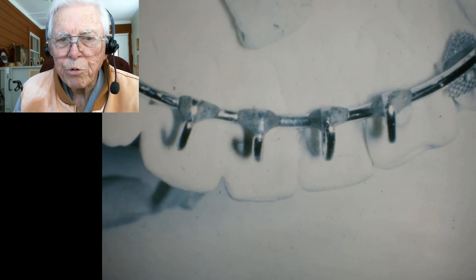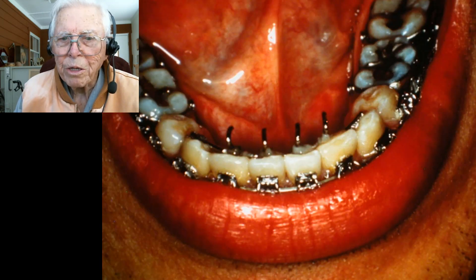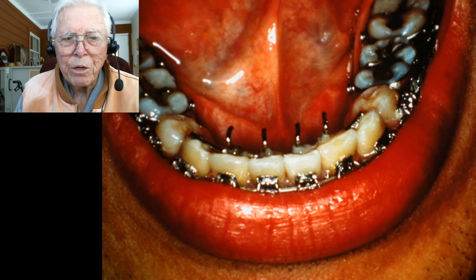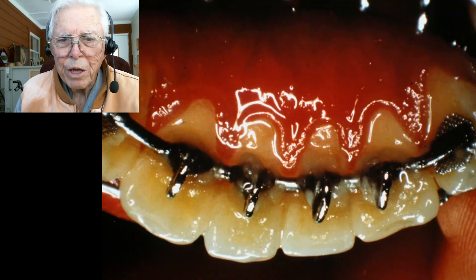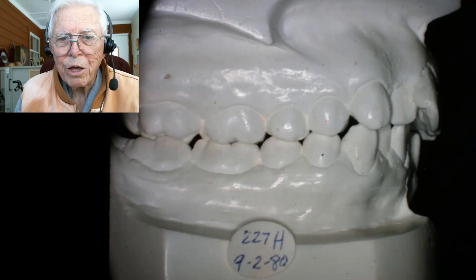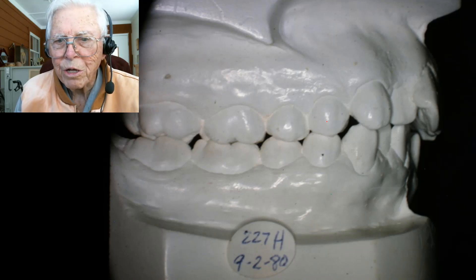We'll start with case number four, where we bought a three-to-three retainer and put the little hooks on it. It had the same effect — we bonded it to the teeth real good, and it does the same thing. We went ahead and bracketed the teeth, and this way you can line the teeth up and don't have the band space in there, but it has a few other drawbacks to it.